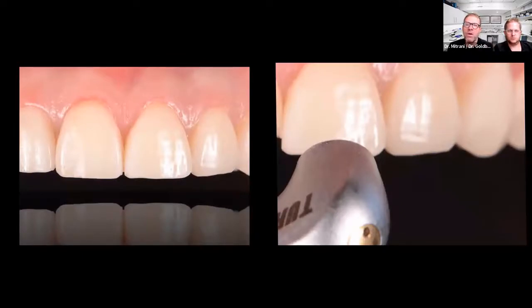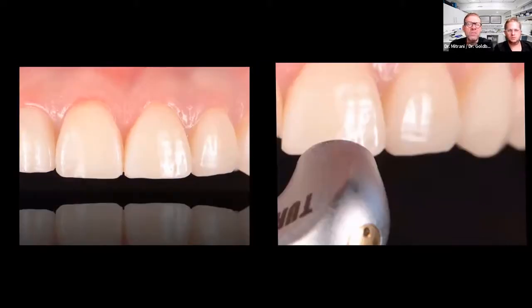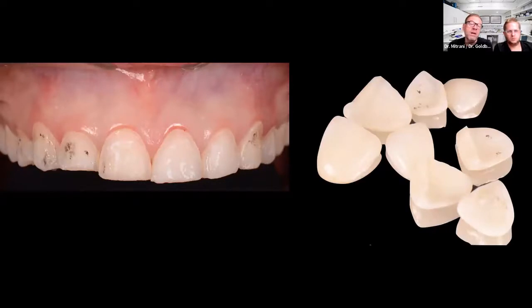And so quickly, we're going to walk you through some of these examples. This, as I mentioned, is a case in which utilizing our laser unit allowed us to retrieve the veneers in a very, very minimally invasive fashion. And some of you may argue, why are you removing the veneers to begin with? Well, the patient wanted longer teeth. You know, beauty is in the eyes of the beholder. This patient did not like the aesthetics of it, wanted wider teeth and longer teeth. So in any event, we went ahead and removed them. And you'll notice right here what a clean cut procedure we're able to do. So we retrieve the veneer in the least invasive fashion.